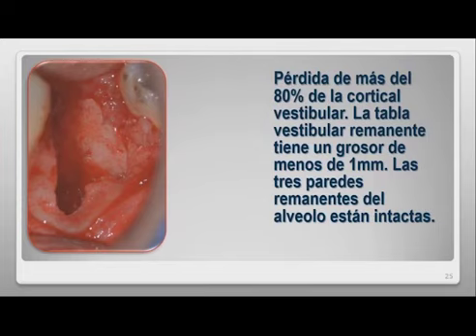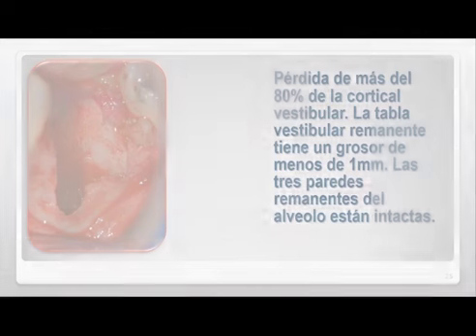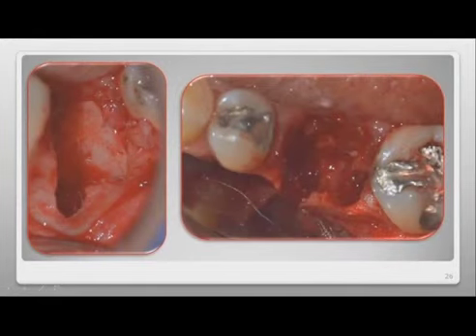If we had handled this lesion surgically, there would have been huge collapse in this area, which would have complicated any type of restoration, whether concerning dental implants or a conventional prosthesis. It is worth noting that the mesial, lingual, and distal walls are almost intact. In this second image, we can see the lesion and how it extends from the occlusal view and the characteristics of the vestibular plate. We can principally observe how this vestibular bone area is not even a millimeter in depth and is lacking thickness. On assessing the post-extraction wound healing biology, we realize that it is almost certain that this bone plate will be lost.